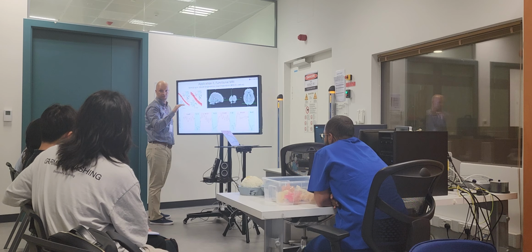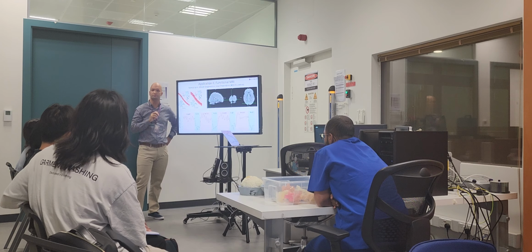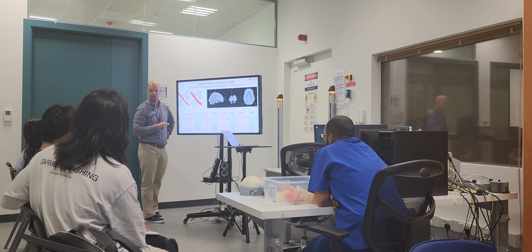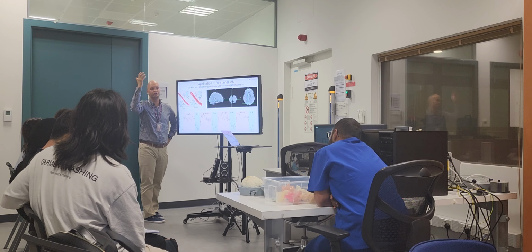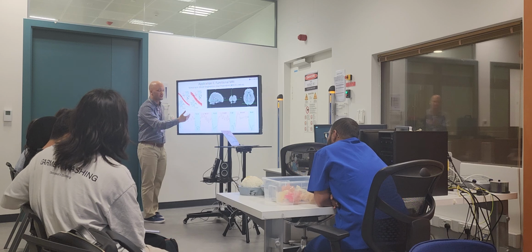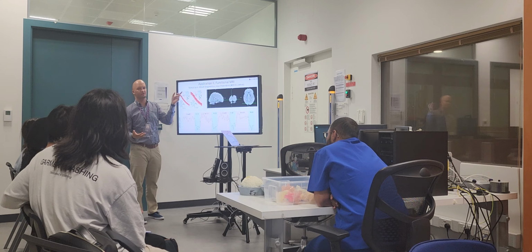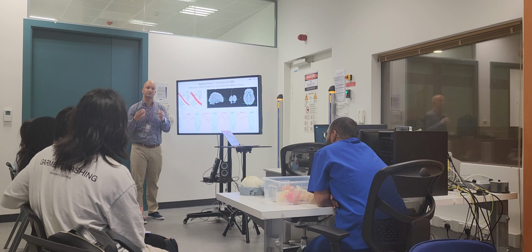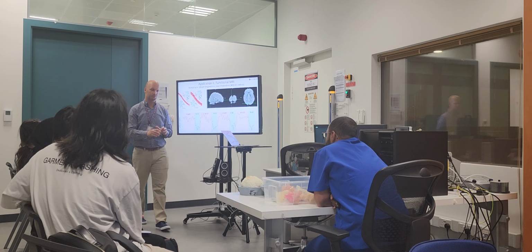We gave her instructions on the screen. Breathe, stop. Breathe, stop. What happens when you stop breathing? More CO2 builds up, more deoxygenated blood in your brain. That actually drops the signal. This is the phenomenon we are exploiting when we are doing functional MRI, say for language, for motor, for vision, for memory, for speech processing. It's using this phenomenon that differences in activated and not activated states, axon firing, translate into a blood oxygenation change. That's what we call the neurovascular coupling.